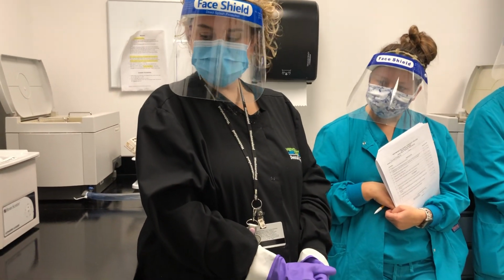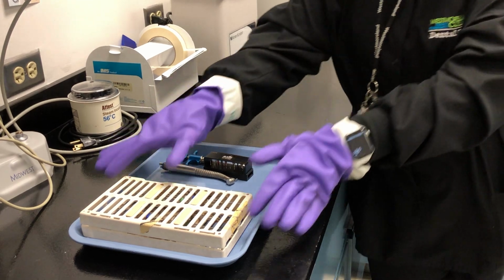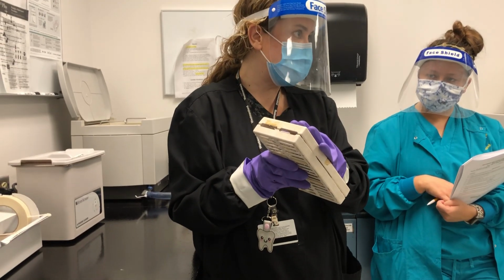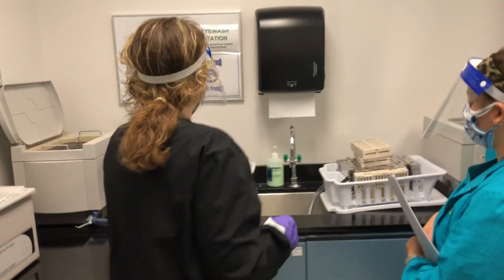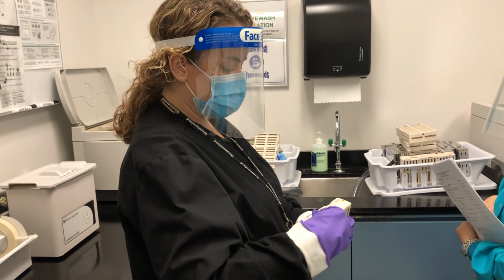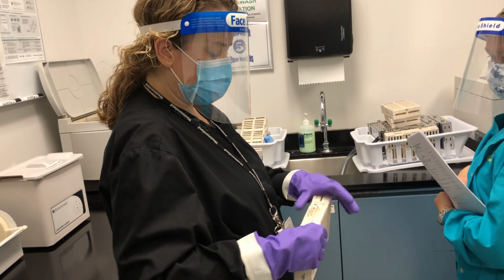Okay, place cassette in the ultrasonic cleaner. To take care of everything on this tray, we would normally take this cassette and stick it in the Biosonic. Because we're pretending today and we don't want to get this wet every time, I'm going to use a pretend cassette, which is right over here. We are going to have two wet and two dry. This is going to be one of our wet ones. It's empty, but you want to make sure these little nuts are turned just like we were doing before, because this could be open. You want to make sure that it's closed when you put it down into the Biosonic.